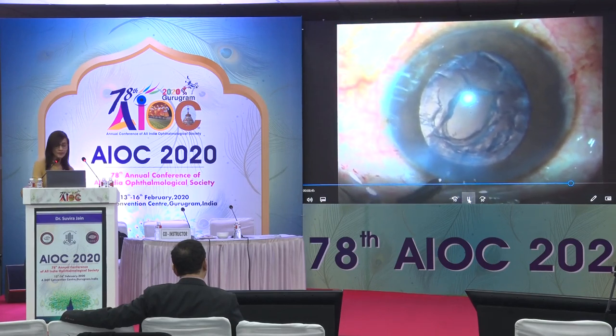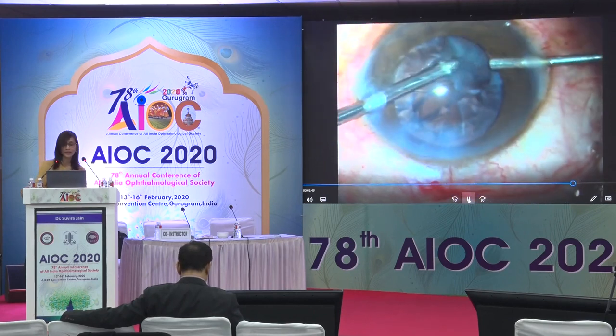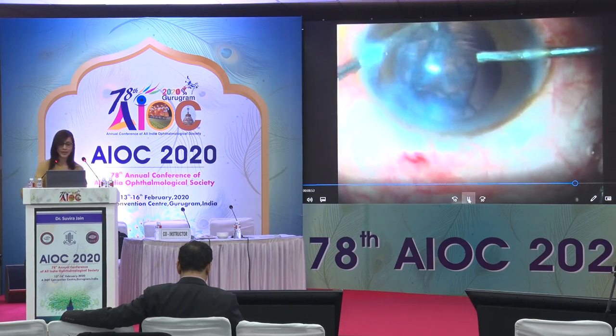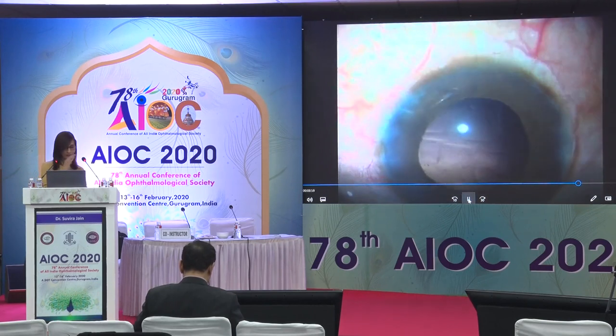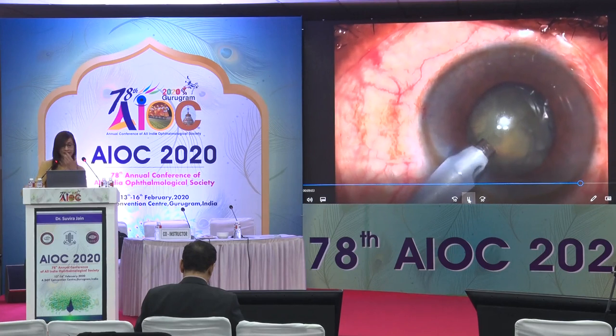The surgeon does the right thing by performing a visco-BSS exchange but notices the opening spontaneously enlarges. So the surgeon then performs a limited anterior vitrectomy. After clearing the vitreous in the disturbed area with the IA cut mode, the surgeon removes all the cortex in a circumferential manner — first from one side then the other — after which an IOL is placed.